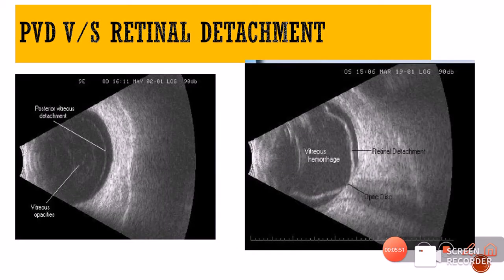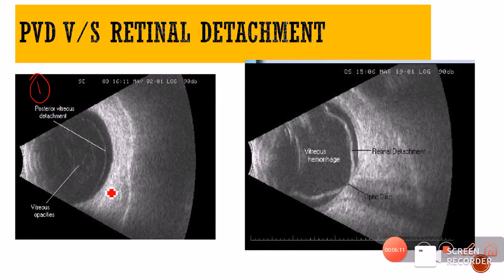Now let us see on B-scan how we differentiate between a PVD and a retinal detachment. The first picture shows a case of posterior vitreous detachment — we can see a faint line of low reflectivity, and this faint line is nothing but the posterior vitreous detachment. This is a complete PVD because we are not seeing any attachment of this PVD to the disc.